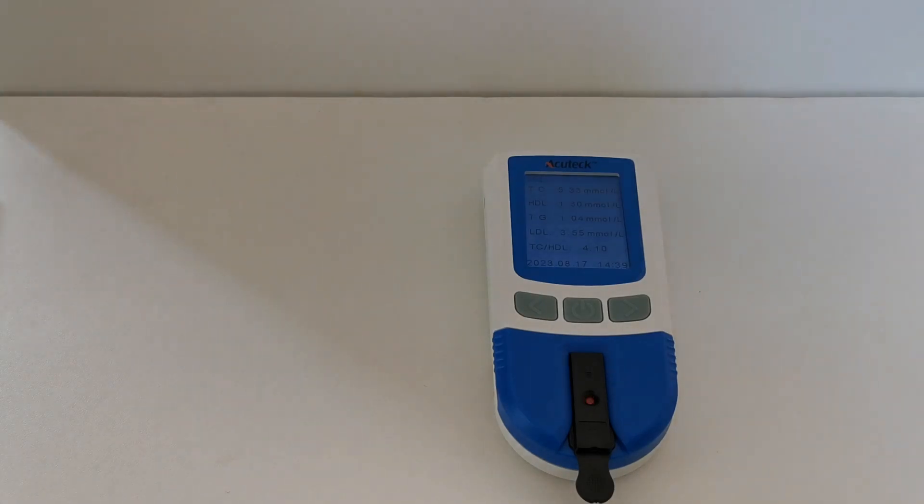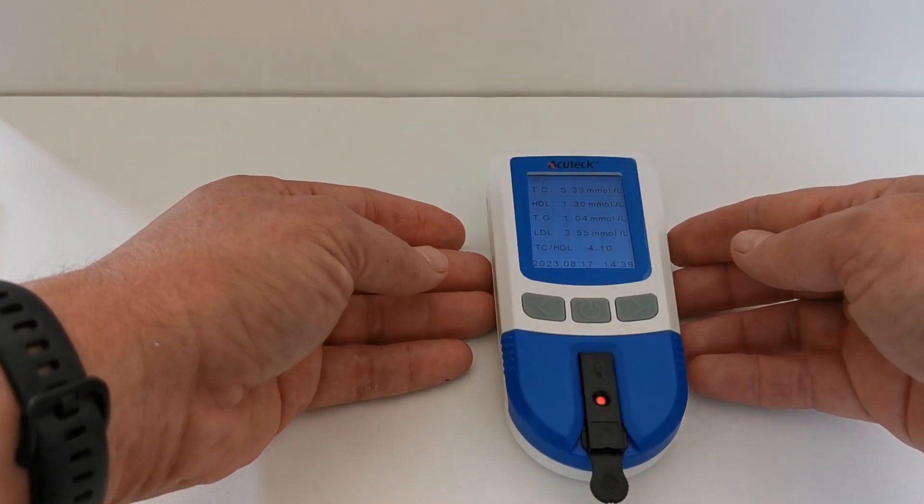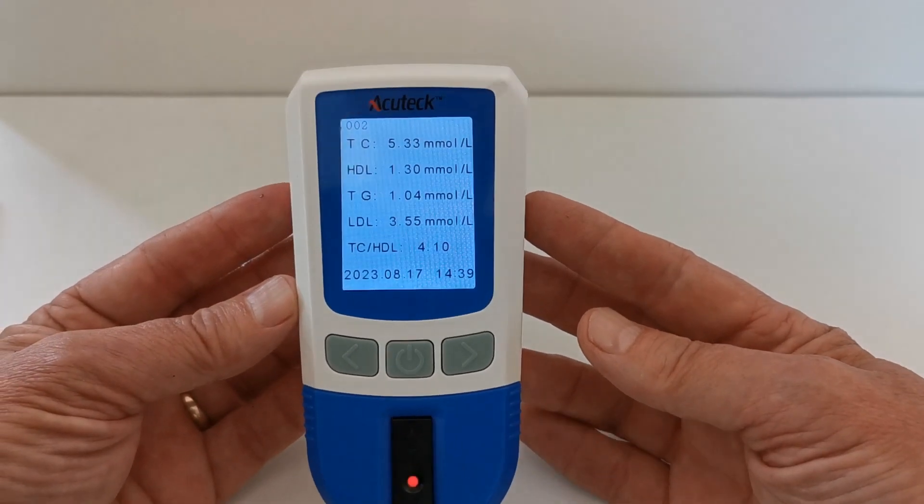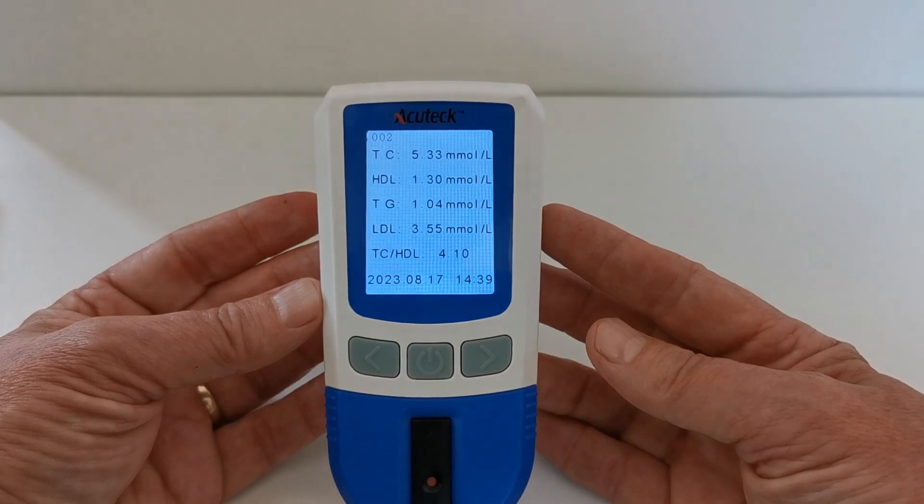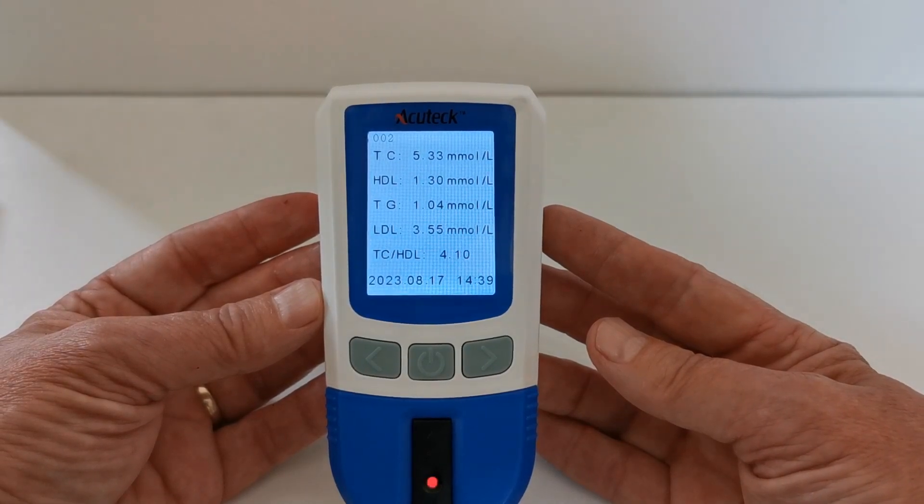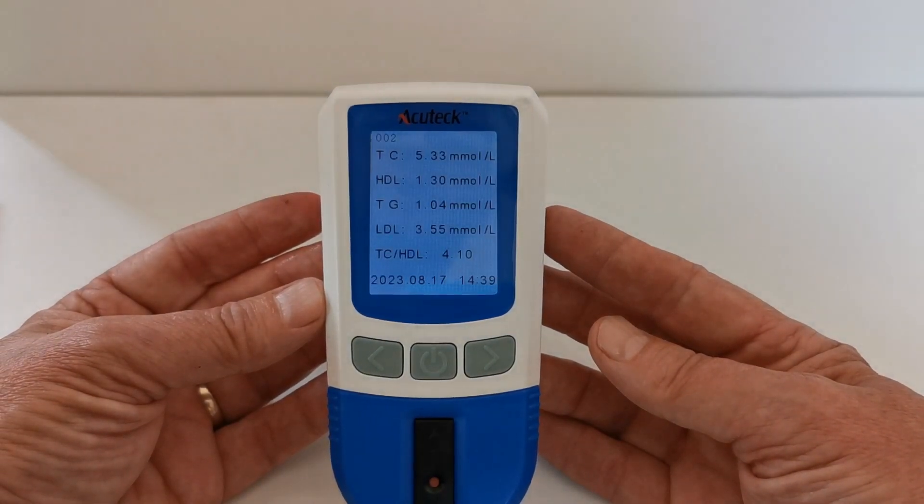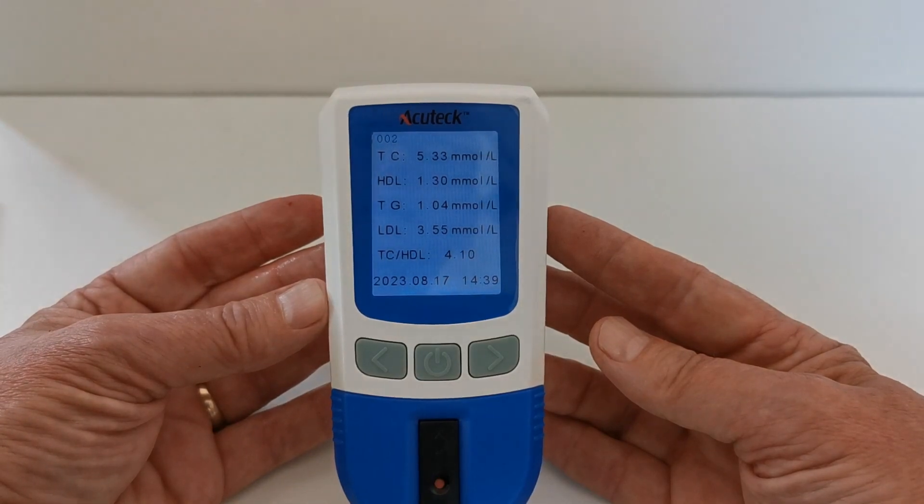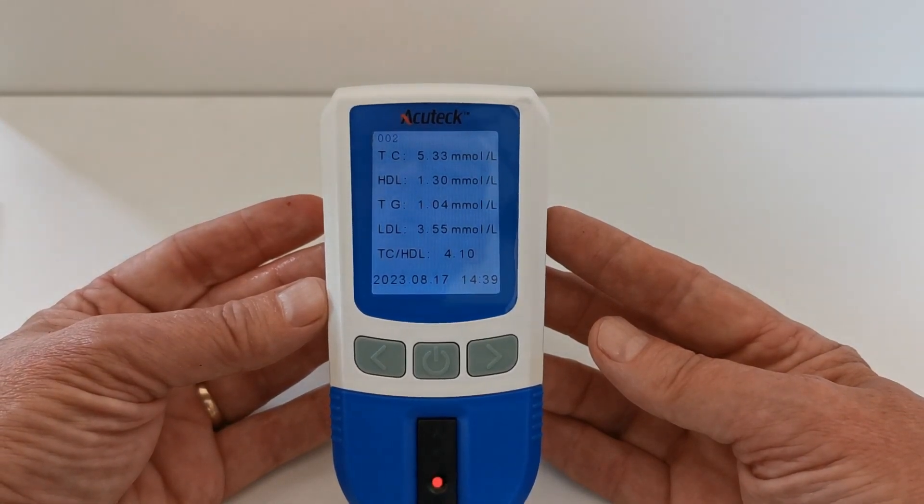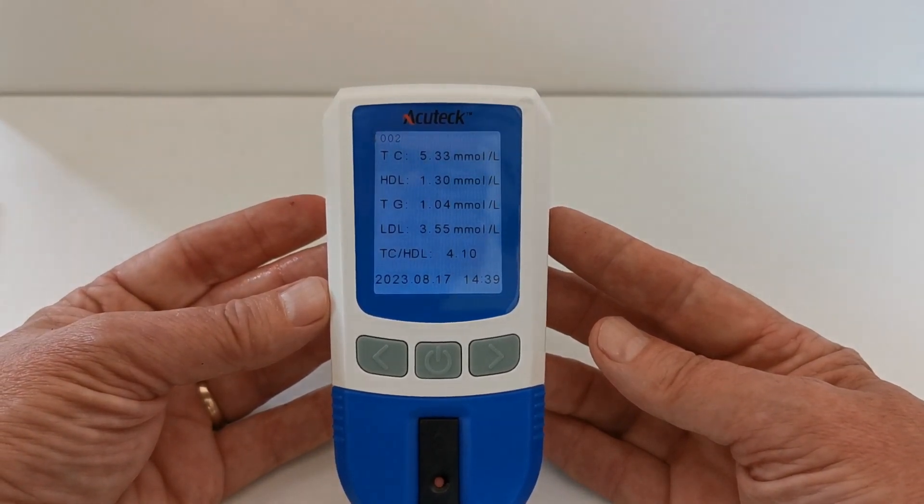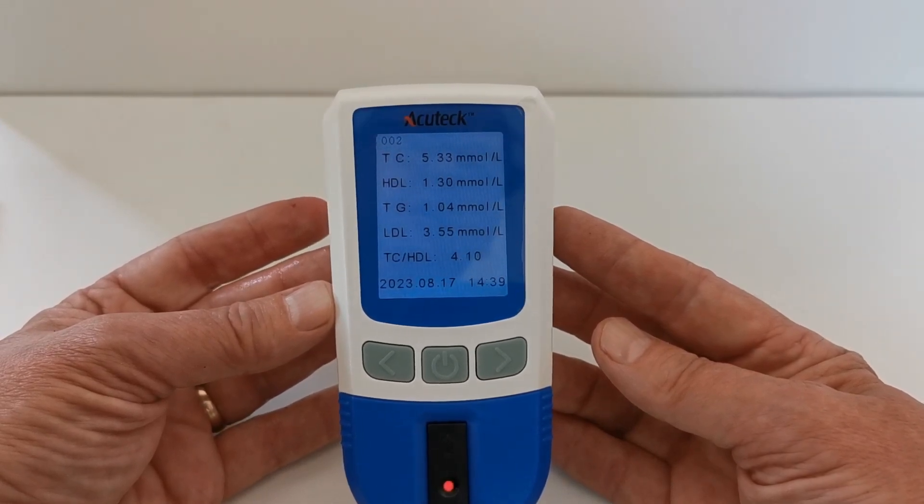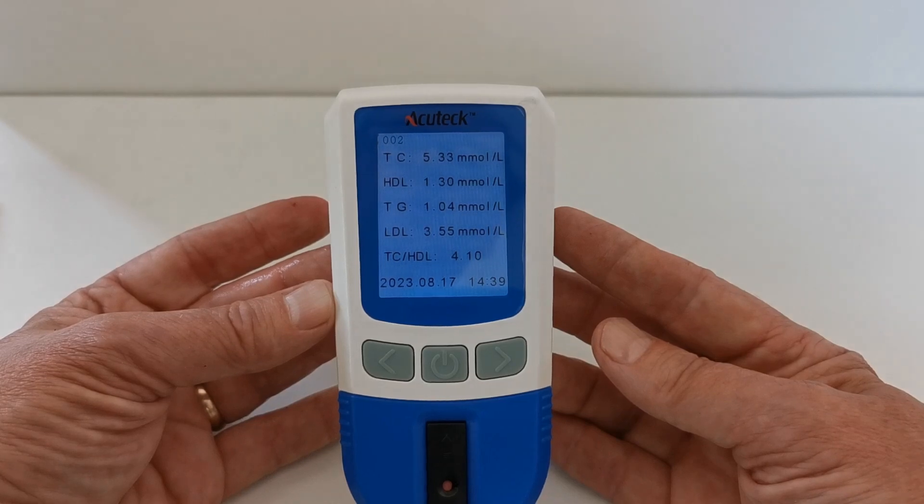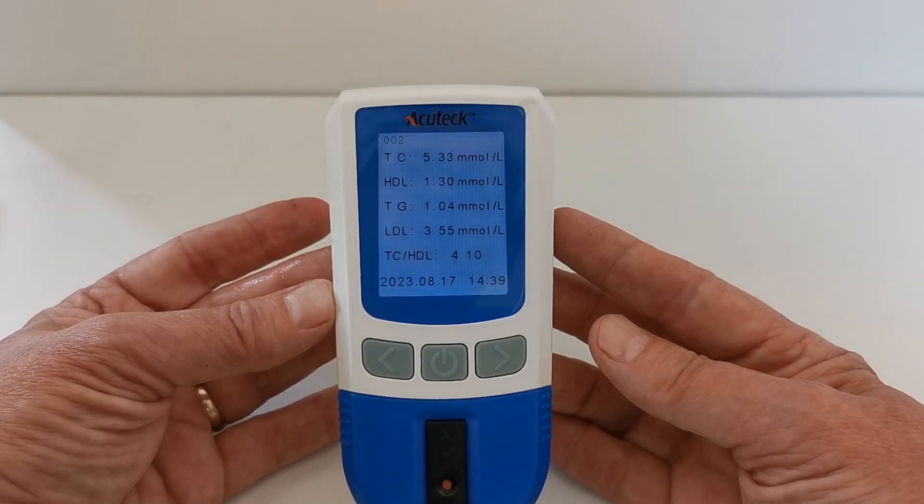Okay, I have the cholesterol results showing now on this display. The total cholesterol is 5.3 millimoles per litre, HDL 1.3, total triglycerides 1.04, and my LDL is 3.55. So the total cholesterol to HDL ratio is 4.10, and the time and date as demonstrated on there is all recorded in the memory on this meter. So that's your first test result.